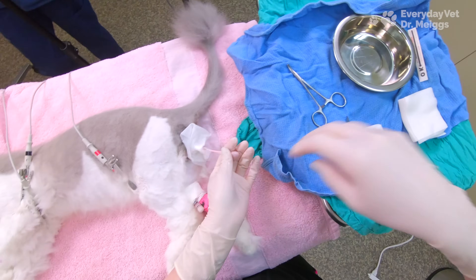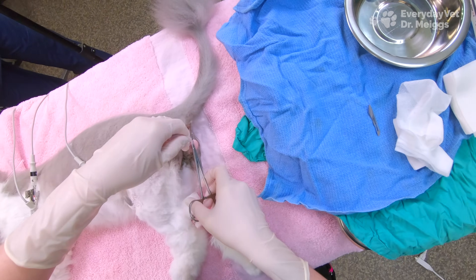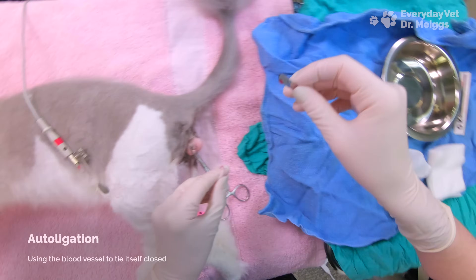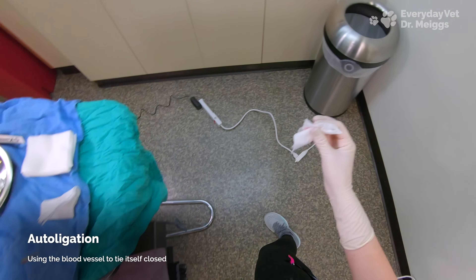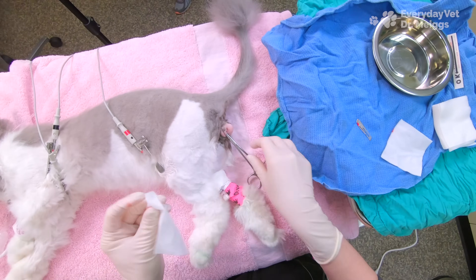Now that I have the cord adequately exteriorized, I can use my hemostats in order to tie a knot in the cord. Cat vessels are small enough that we can tie them in a knot rather than using suture. Anytime we use foreign materials such as suture there's going to be a risk of reaction or rejection by the body. So with this method called auto-ligation, the body's own tissues are being used, eliminating the risk of reaction.